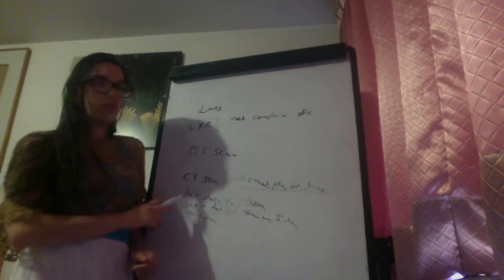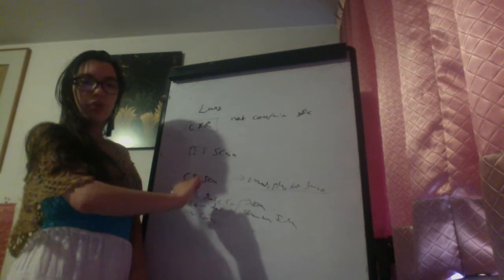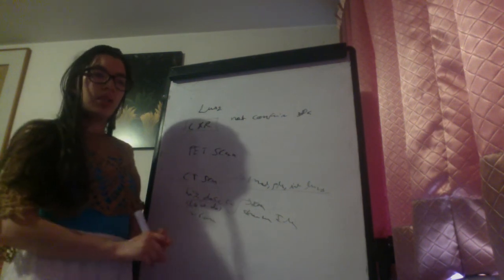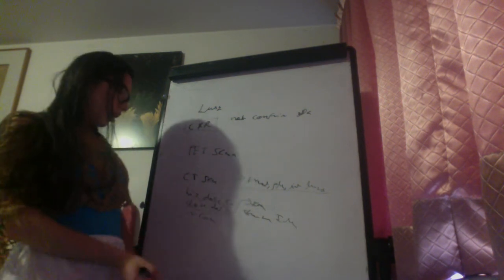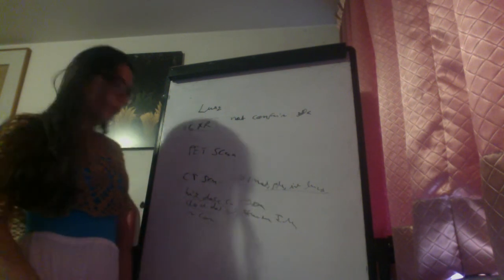Sometimes we can also use the CT angiography, in which we put a bolus of contrast and we do the CT scan, while the intravenous contrast makes the pulmonary artery tree more visible. And this will be diagnostic for a pulmonary thromboembolism.